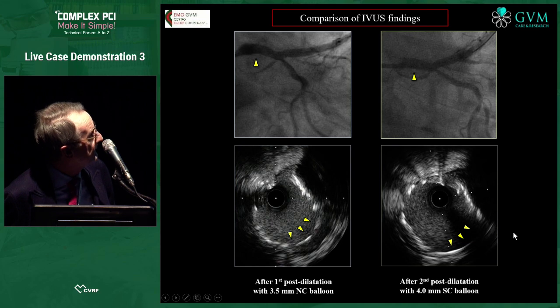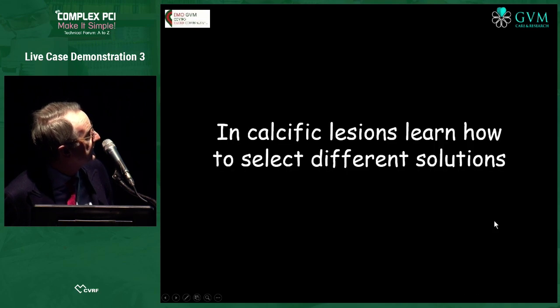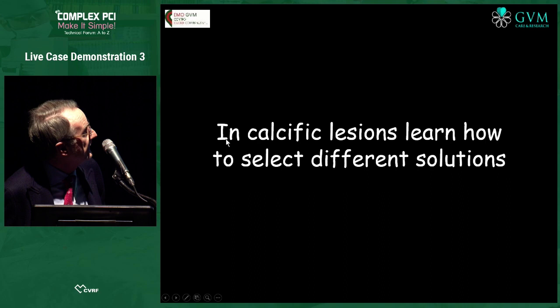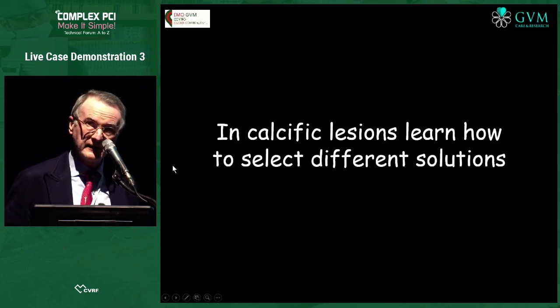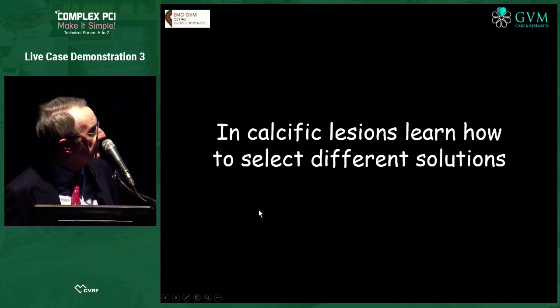And here are the two pictures. So I would say in calcific lesion, learn how to select different solutions and do not always be concentrated on a high-pressure, non-compliant balloon. Thank you for your attention.